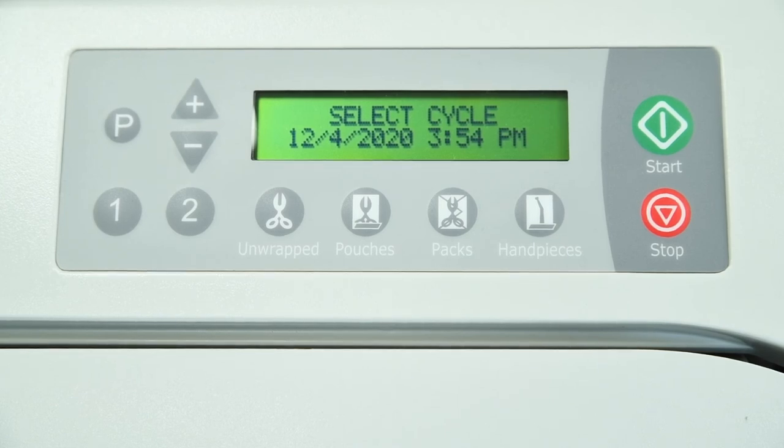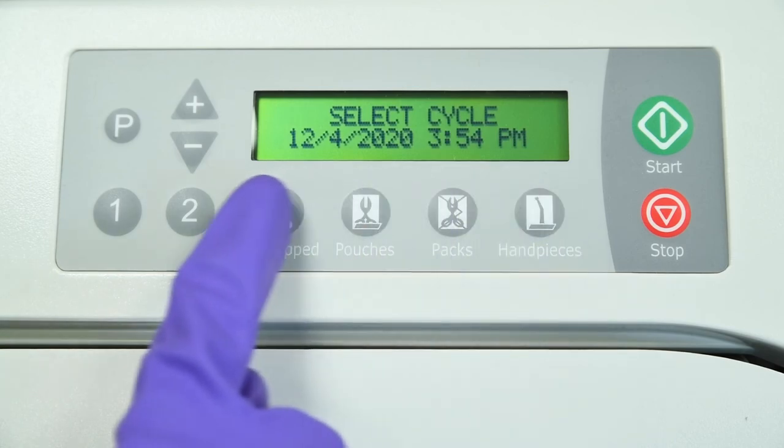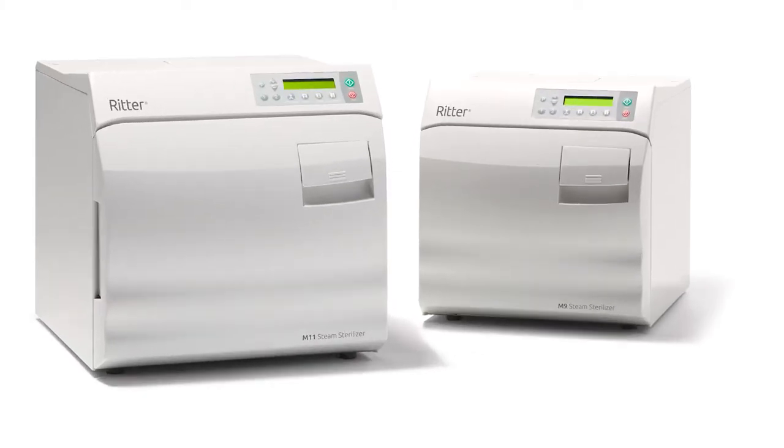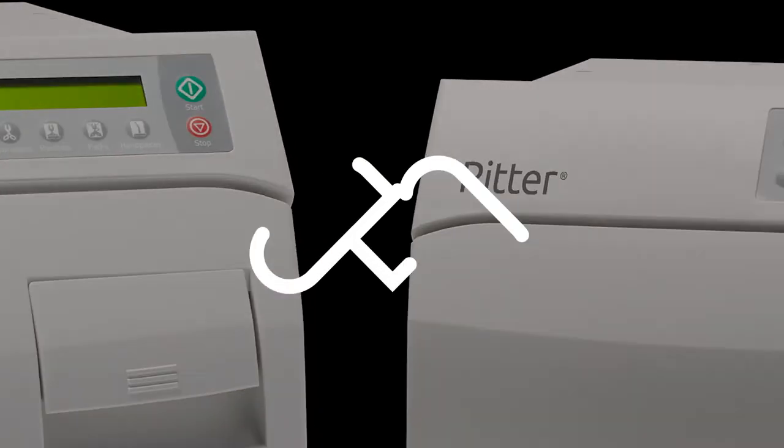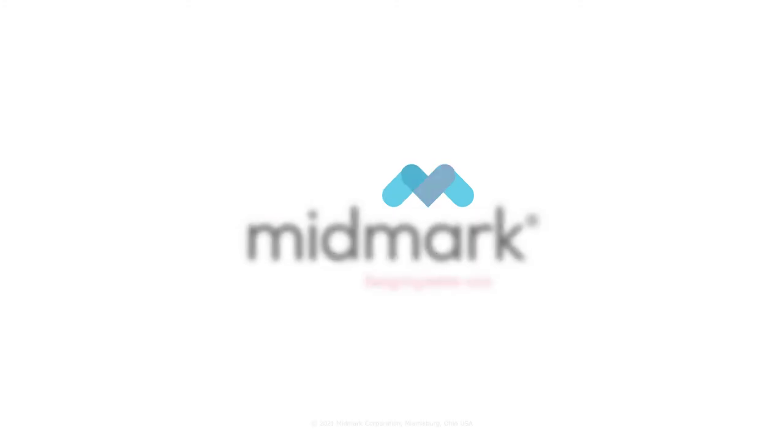When maintenance is complete, the 'perform monthly maintenance' message will disappear during your next sterilization cycle. Ritter M9 and M11 steam sterilizers are designed and tested to provide exceptional reliability throughout their service life. To ensure integrity, performance, and safety of all major components, it is the responsibility of the user to have the sterilizer performance and operation verified by a Midmark authorized service provider at least every 10 years or 10,000 cycles, whichever comes first. For more detailed information about your sterilizer, please refer to the M9-M11 user guide.